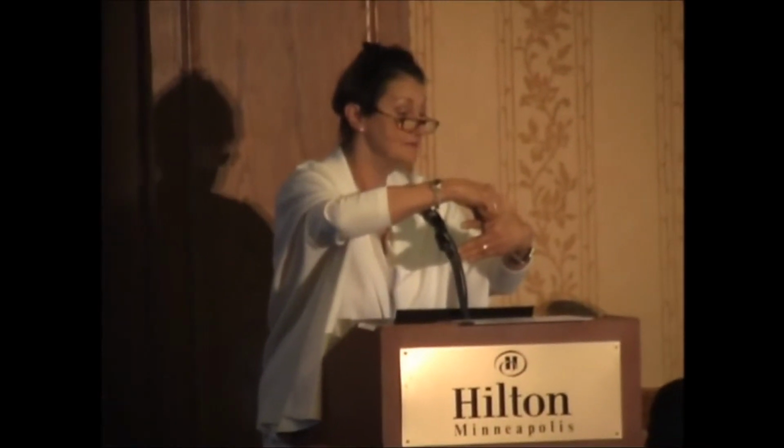First you measure the flow in the graft, then you snare the native artery proximally, and then measure the graft again. What you usually see in competitive flow, and I must say, Rune, your experimental work really mirrors exactly what I found clinically. So this, to me, was very exciting to hear your talk, because it really fits. Competitive flow is shown when the flow goes up and the pulsatility index goes down.